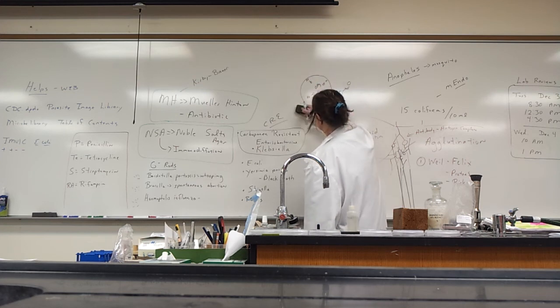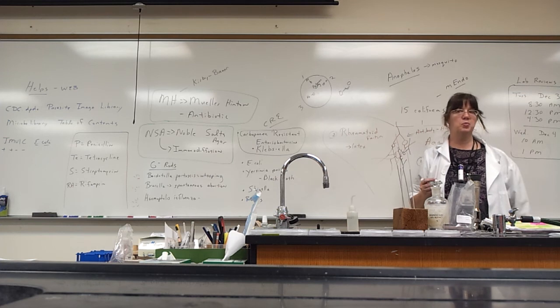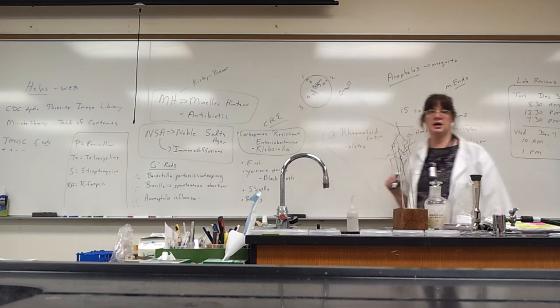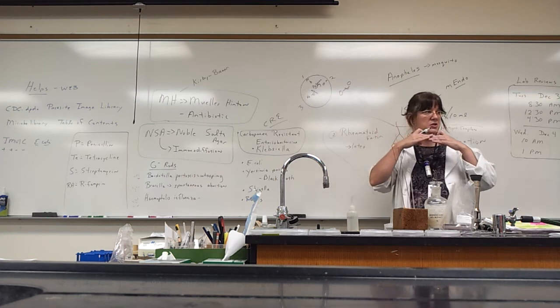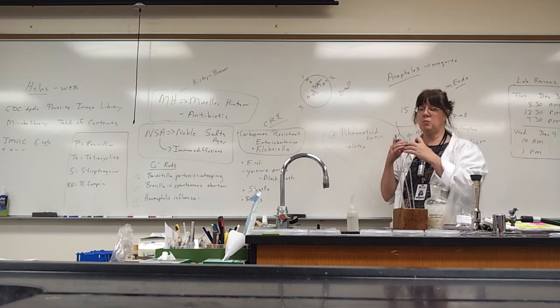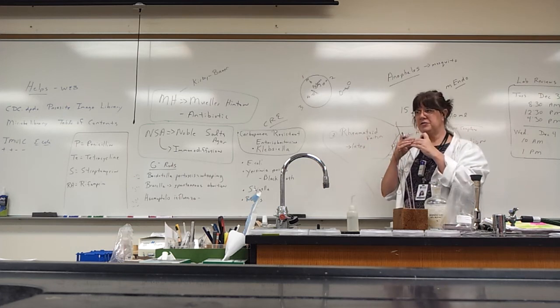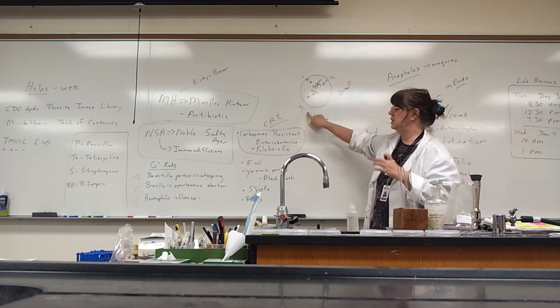Okay, let's switch again. There's a lot of ways you can do this. This is actually up here on a drawing that another class will do. What if your center was pertussis, and this is patient 1, 2, and 3, and you want to know if any of your patients had whooping cough? What if the line formed there? Wherever the line forms, it matches. Wherever there is a pale white line, there are some here for you to practice seeing. That pale white line is what you're going for.